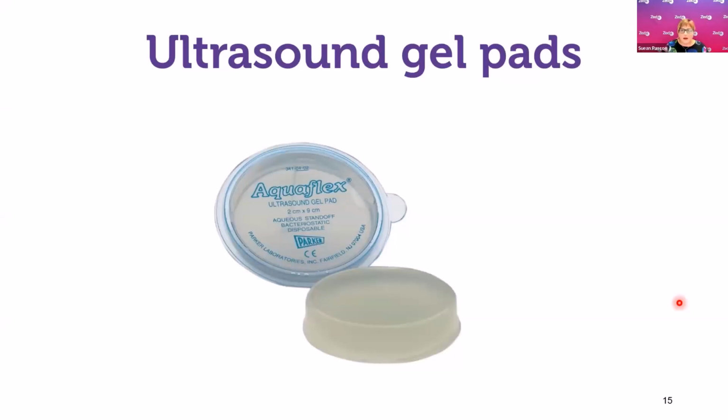It's possible to purchase manufactured gel pads like these. They can sometimes be a little bit hard to come by, and there's only a few people that manufacture them. Because of the nature of foreign bodies, these gel pads are created as disposable items, so it can get quite expensive as well. Even with these gel pads, you do need to put a little bit of gel on the skin, then the gel pad, and a bit of gel on the top of the gel pad. The other thing to note with these manufactured gel pads is that they come with a shelf life, as we discovered. After a little while, if you exceed their expiration date, they tend to dry up and become hard lumps of agar gel. So you do need to make sure that they are within their use-by date.